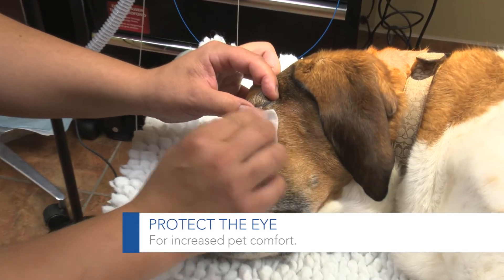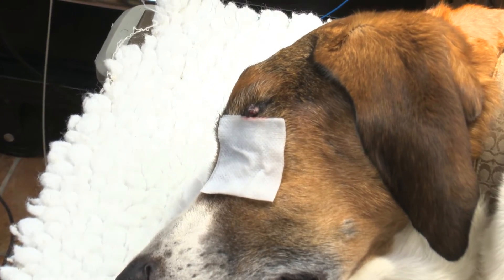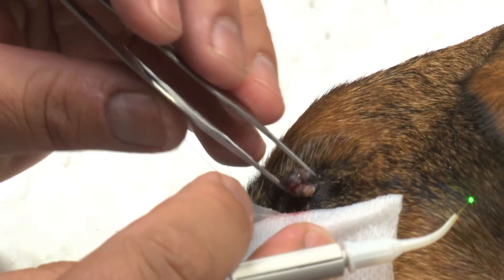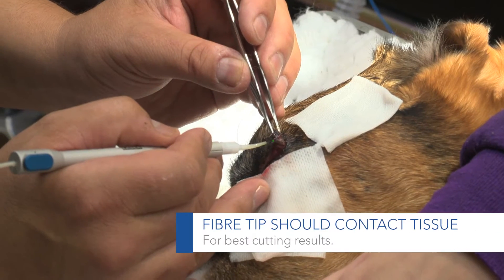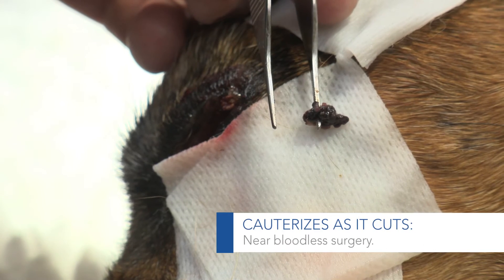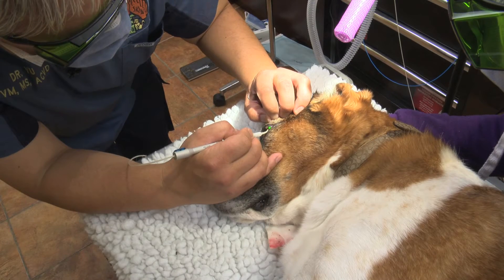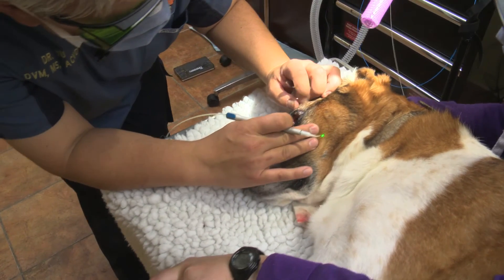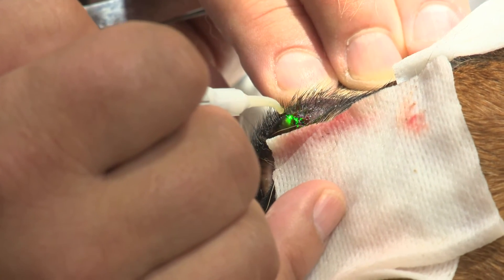A couple of things that you want to do is definitely cover the eye with some saline or water-soaked gauze. So I'm going to gently pick it up. We're going to go away from the eyeball as we're laser ablating this. And now we're going to just make sure that we ablate the base of it. We're doing some light passes here to cauterize that tissue.